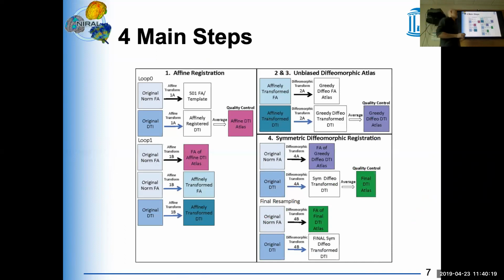People have argued that this is not really necessary. Just doing this enough times, this final step, gives you something very similar. And mathematically, that's not exactly correct. But from a pragmatic viewpoint of actually applying it, practically it's probably the same. There's probably not much difference.